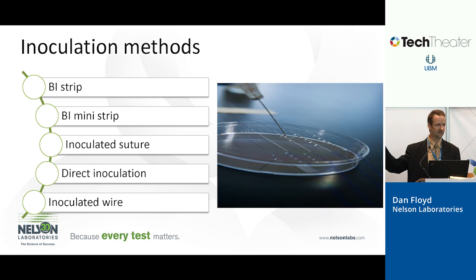This is where we inoculate surgical sutures with the liquid spore suspension. So we're putting the spores on in an ethanol-based solution. That ethanol then flashes off, it evaporates off, leaving just the spores on that suture. Then you can place that suture down inside that narrow lumen. Or sometimes you use the liquid alone and put that on one of those mated surfaces where they're going to be pressed up against each other. So you'll put it on that surface, allow the spores to dry on there, and then reassemble the device.